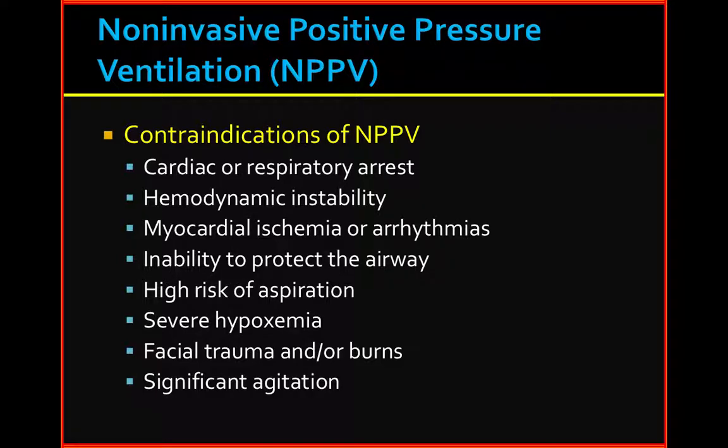So you can think of this as almost a weaning mode. So you start out with AC, and then you can switch them over to SIMV as they wake up more to get them back to their natural states. Is everyone with me? That's the take-home message of here. Now I'm only going to show you, I think, a little bit more and we're done with this.